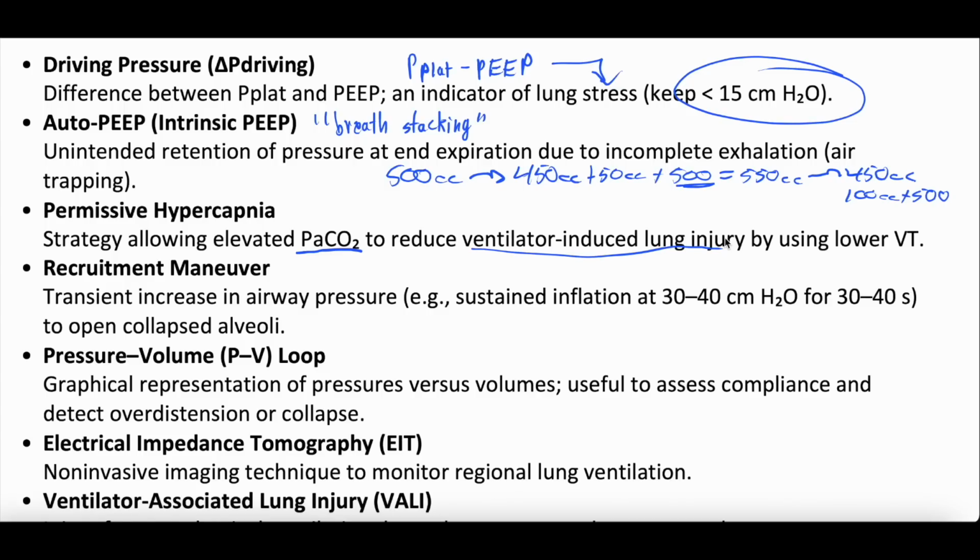We really want to make sure those patients aren't getting barotrauma, which is where you get kind of overdistension in the alveoli causing damage. So we will drop their tidal volumes lower, 6 cc's, 5 cc's per kg, target a certain plat pressure. We have a whole series on ARDS too, so check that out. But we'll allow them to have some permissive hypercapnia. We won't try to aggressively make their carbon dioxide normal because by doing so, we'll cause more lung damage. So instead, we let the carbon dioxide stay a little high if it means that we can have better control of any injury to their lungs.